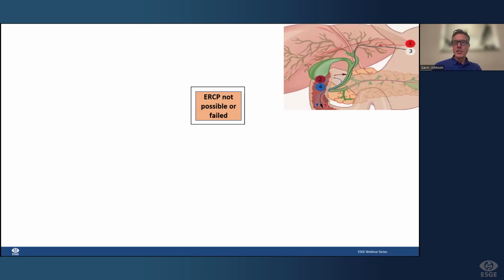Number 3 is to use the left liver as a conduit to the papilla, either by using a rendezvous technique where you swap out to ERCP, or indeed in the context of a stricture, stenting antegrade down through the liver and down on fluoroscopy. And if the duodenum is an option, you can stent straight into the bile duct. That's number 2, a choledochoduodenostomy, which has gained great traction in the advent of LAMS. And 4 is using the duodenum as a conduit to the bile duct for a rendezvous maneuver, which can be a little bit tricky and challenging in benign disease.